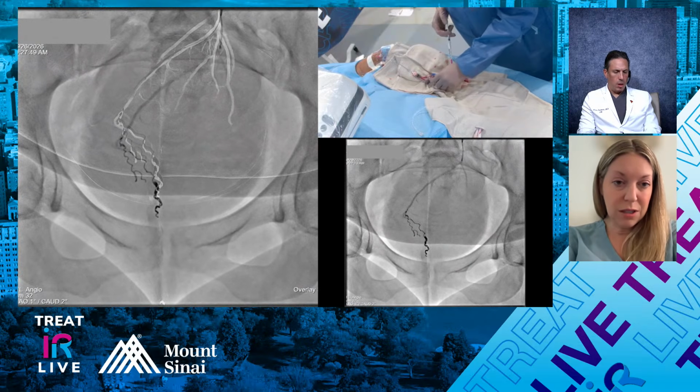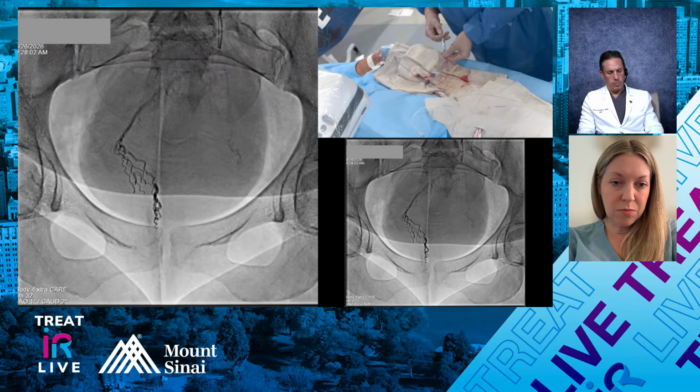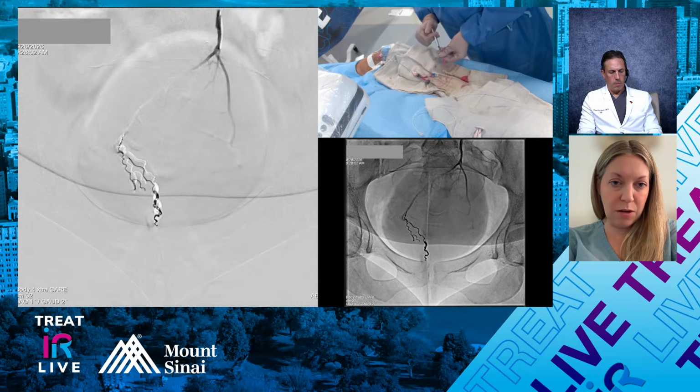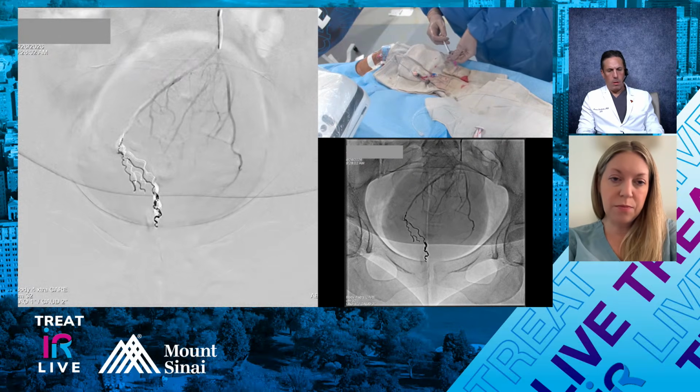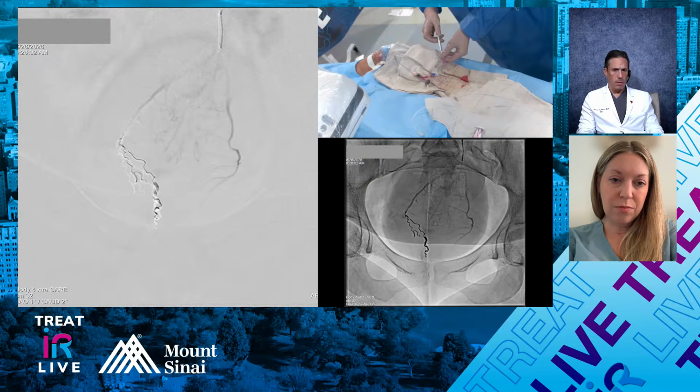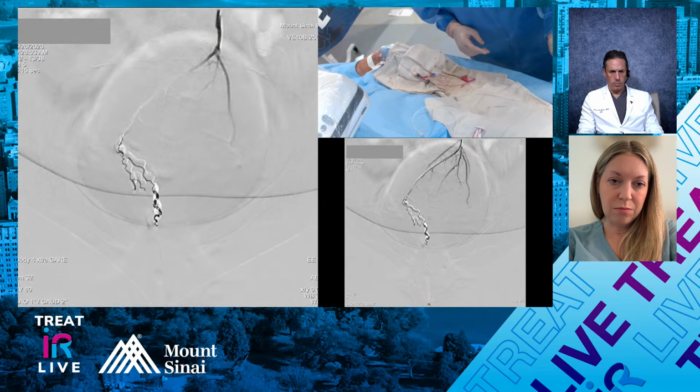So yeah, my original run was a power run, which I still want to show at some point, but we did it through the base catheter, not through the micro. You can just see the top of the base catheter. I don't know if it's appearing on your screen. So we're pretty well in there. We're seated very, very well from radial access here.